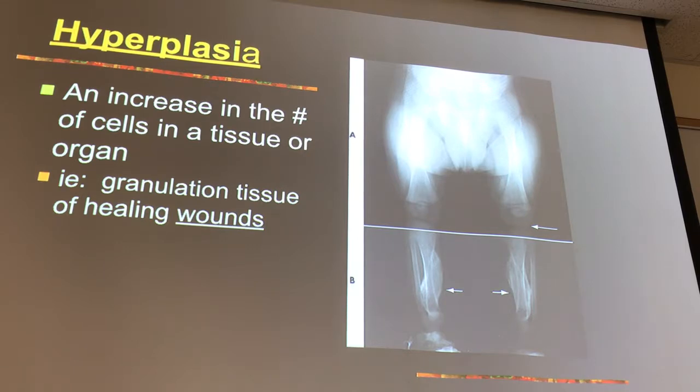It's going to shut off too soon, and you don't have a good exposure. So the 15% rule has nothing to do with the AEC. You have everything to do with the AEC. You need to select it, you need to know which ones are on, and you need to get the part over it. Is this bringing back memories for some of you? Yeah? Okay, big deal.